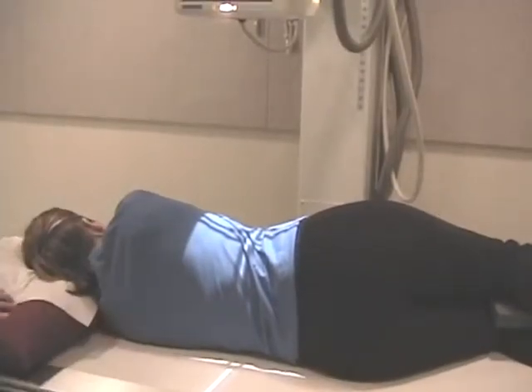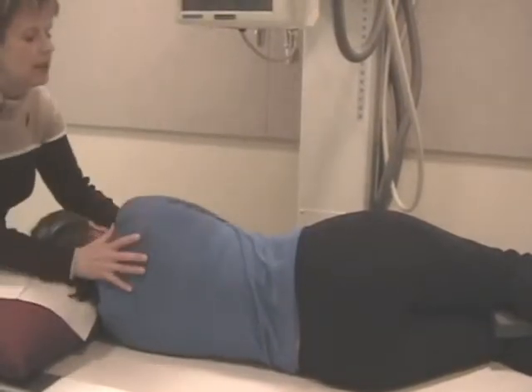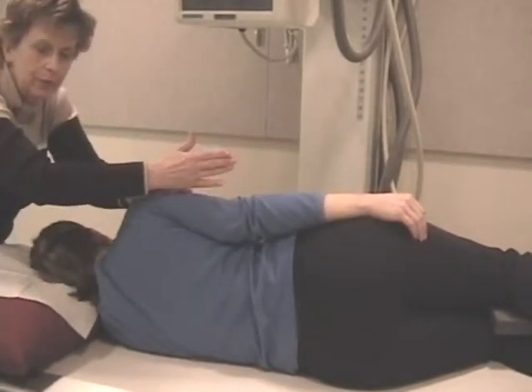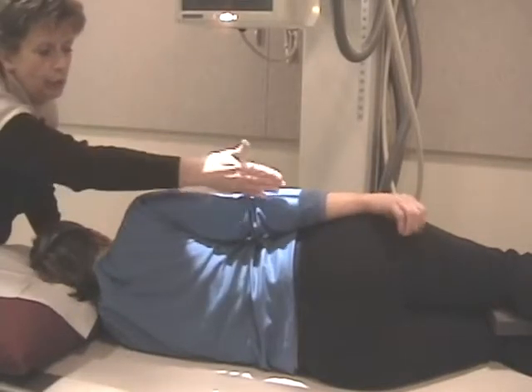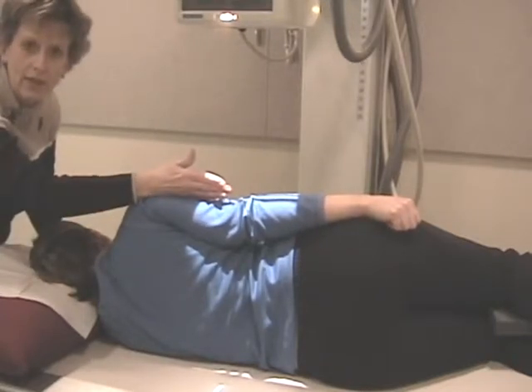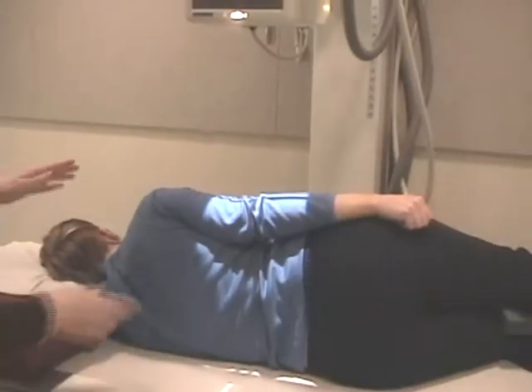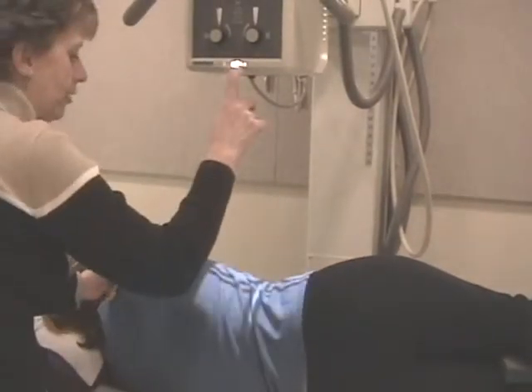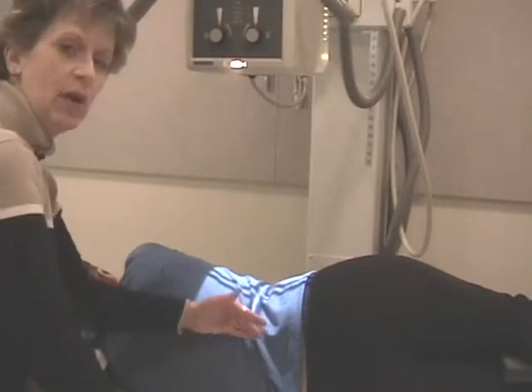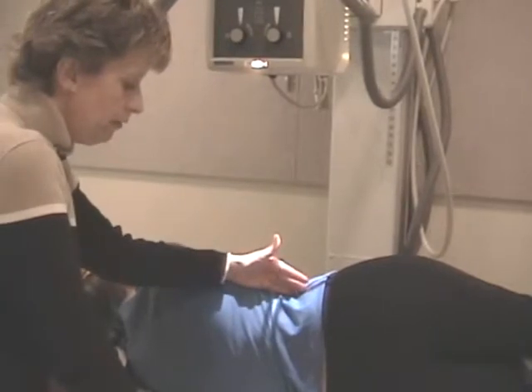Okay, what we do with that, because we're just starting you on spines, is with the arm down to their side, somewhat posterior. This crosshair comes right down the middle of the axilla. That's why they call it the mid-axillary line. This crosshair is coming right down the center of her arm. Once you've practiced this a few times, you won't have to put the patient's arm down to their side. You will just look and you can see where the spine is. Remember, there's not very much tissue on the back wall. You have spinous processes, and then right there is the lumbar vertebra itself.